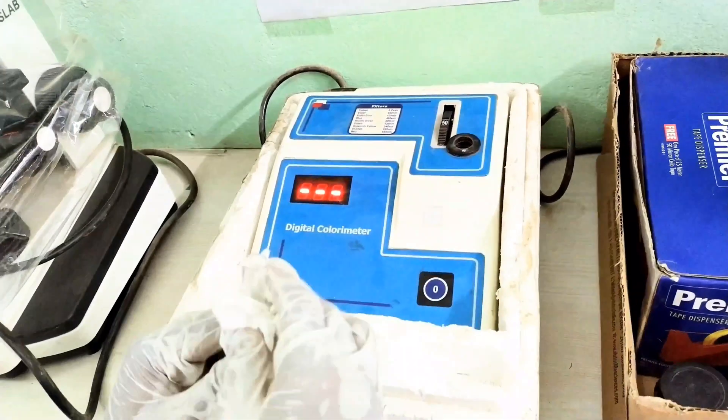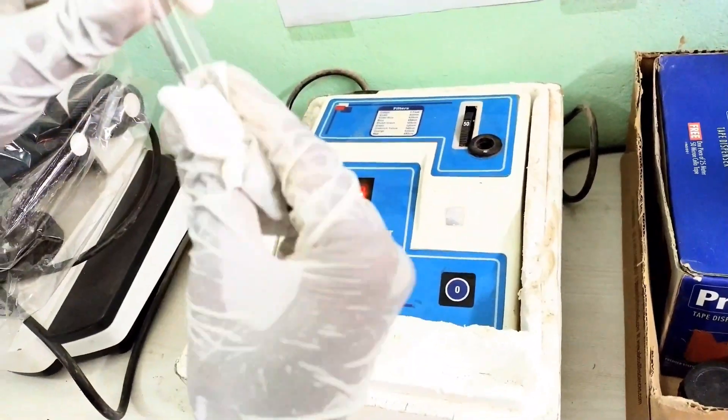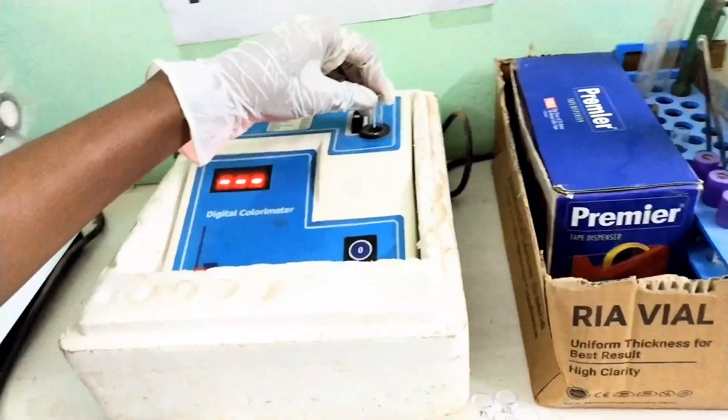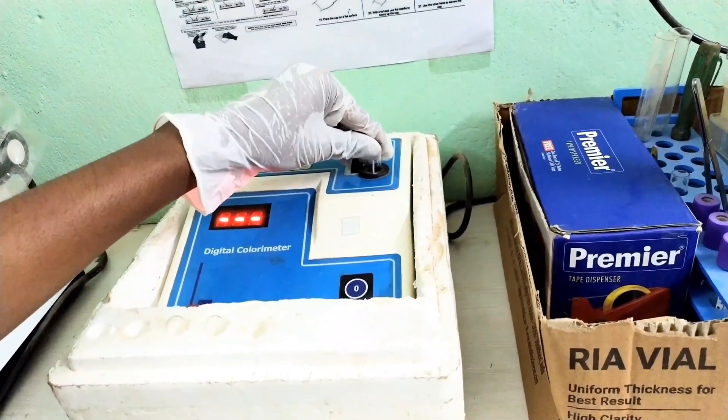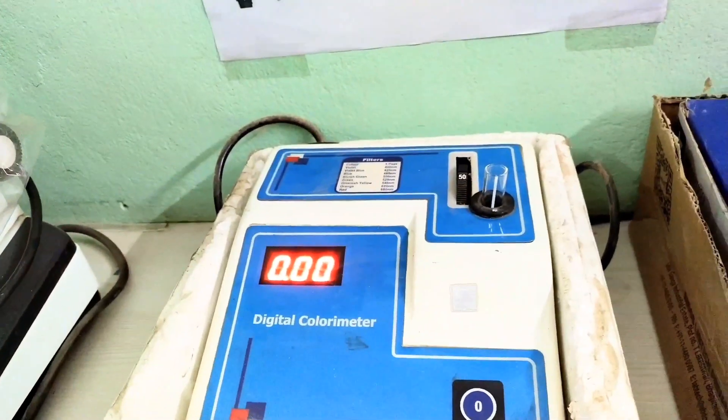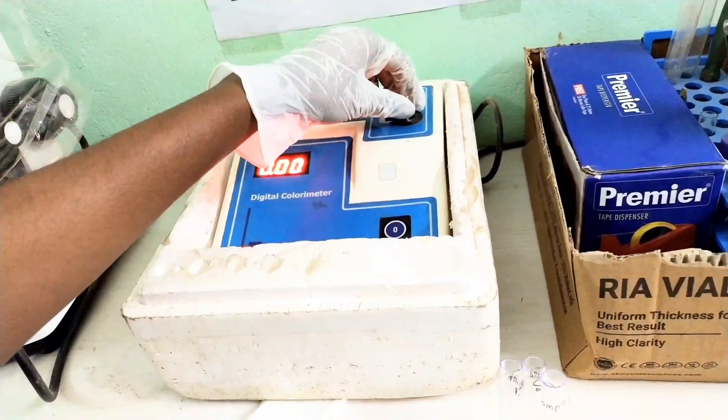After 5 minutes of incubation, read all the samples with the help of a colorimeter. Set the colorimeter with plain distilled water. The uric acid test is done at 500 to 540 nm wavelength in the colorimeter.